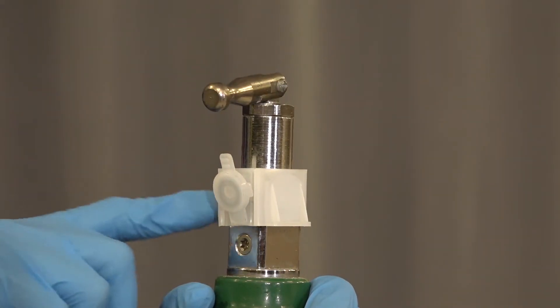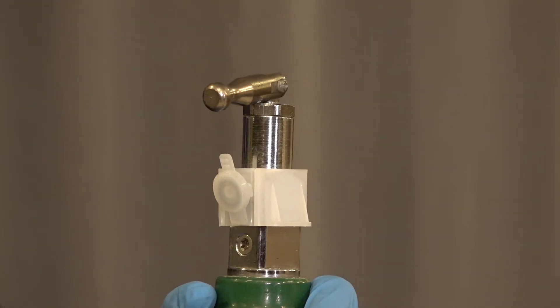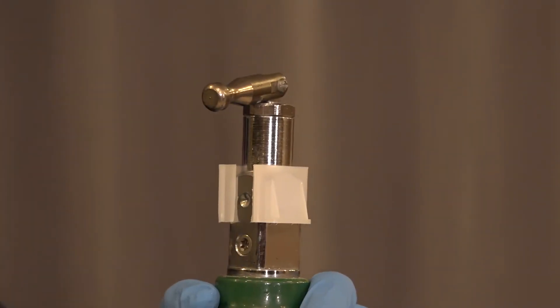On a recently refilled tank, we take a look at the yoke of the tank and we see there's a covering over the holes through which the oxygen is going to come out. We're going to open up and remove that covering by peeling it away.